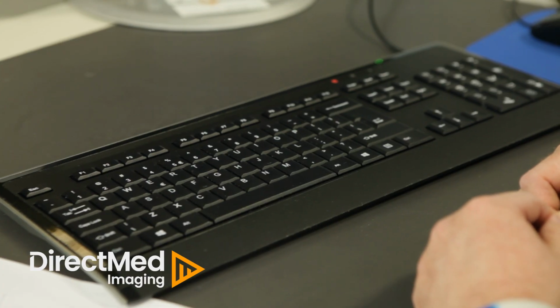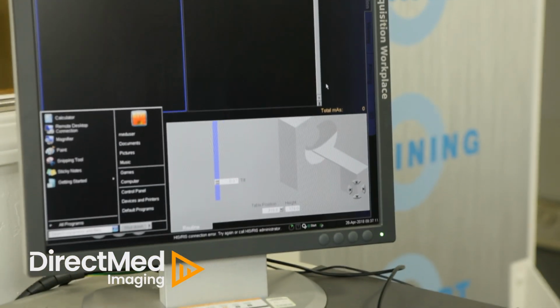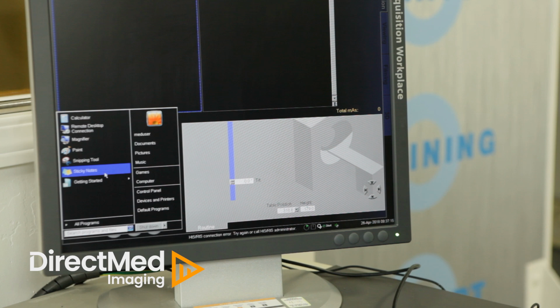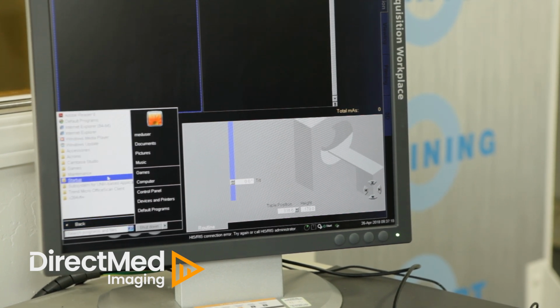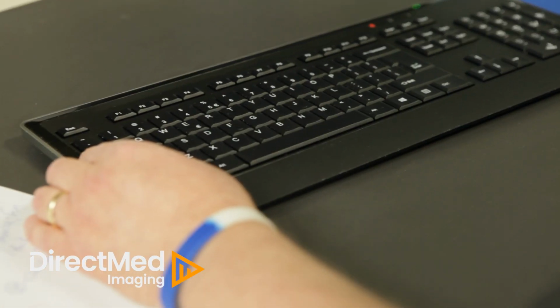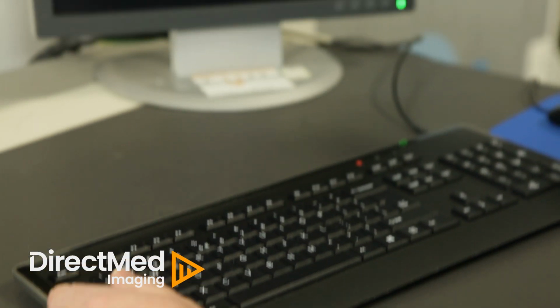So now that our Windows key is activated and we can bring up the Windows Start menu, we can navigate through Windows traditionally by selecting from the Start menu directly or going into the programs that are available. Another option is to use keyboard shortcuts. In this case, let's look at the Windows key D. That brings us to our desktop.